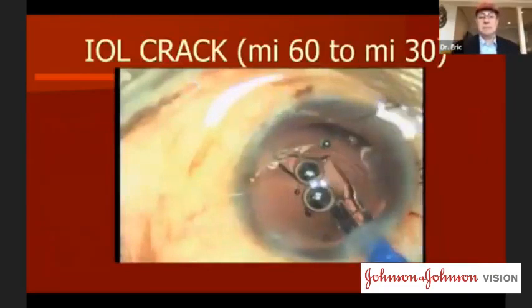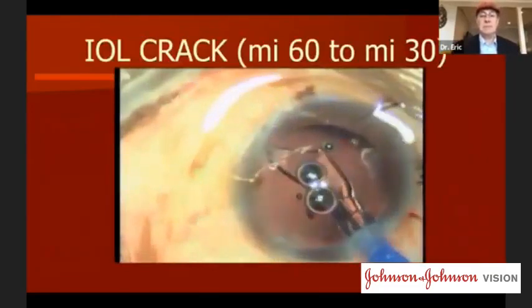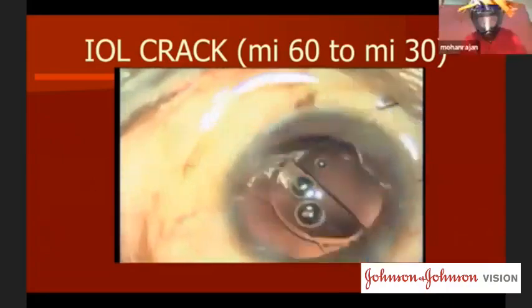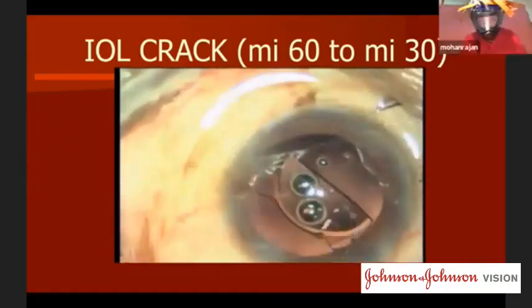So look at this MI60. Basically, it was introduced in 2005. It didn't have a good cartridge, and only half the lens came into the eye. That's called the MI60 lens.